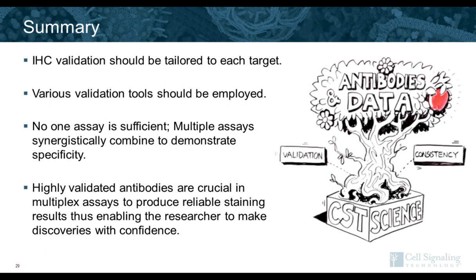With manual staining, you're using the microwave, and with the Bond and the Ultra, you're not. You're just using heat. So there's little differences there. The protocol time to do it on the Bond or the Ultra is basically an overnight stain. It's an overnight run, whereas doing it manually just takes a little bit longer.